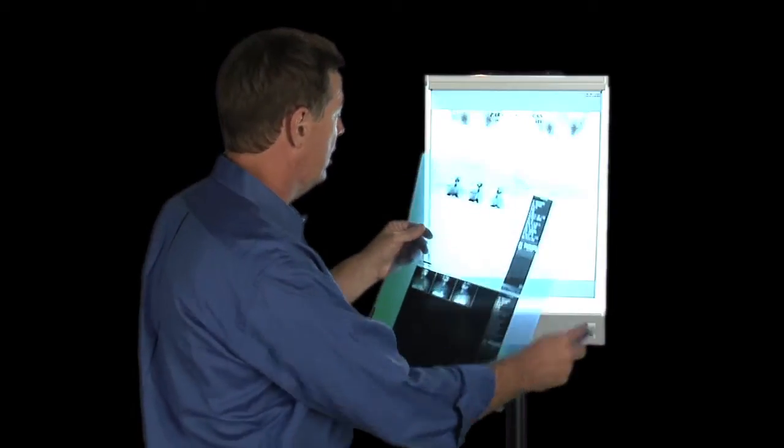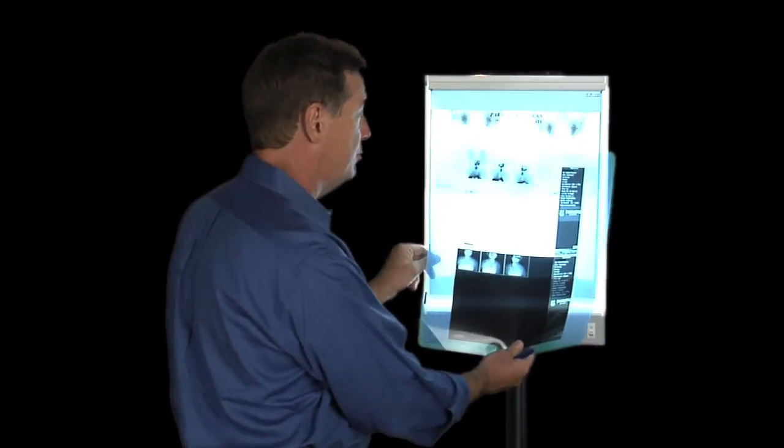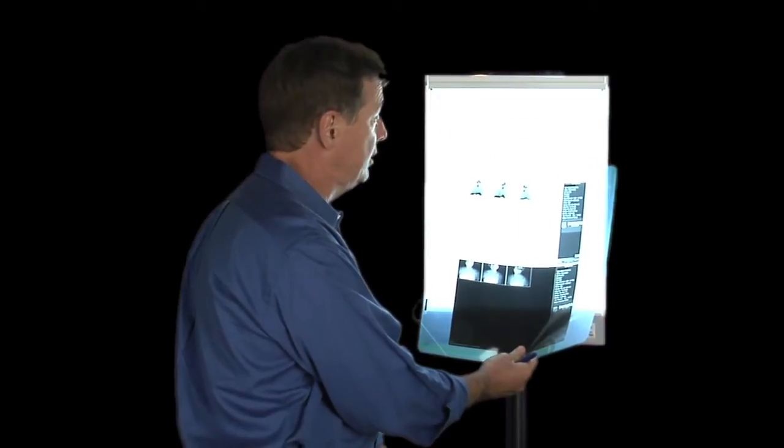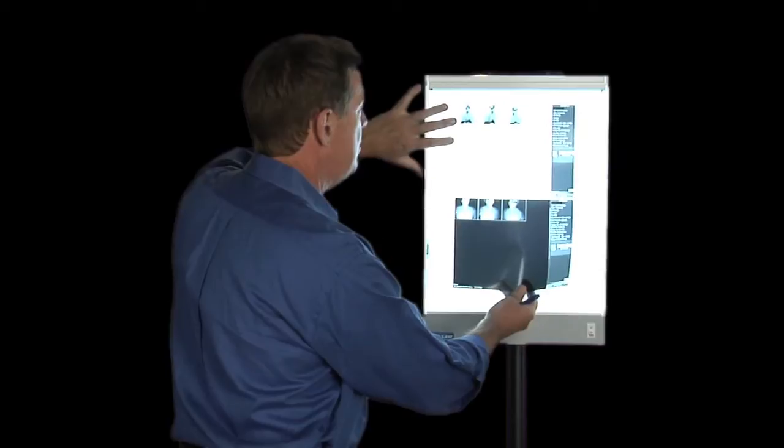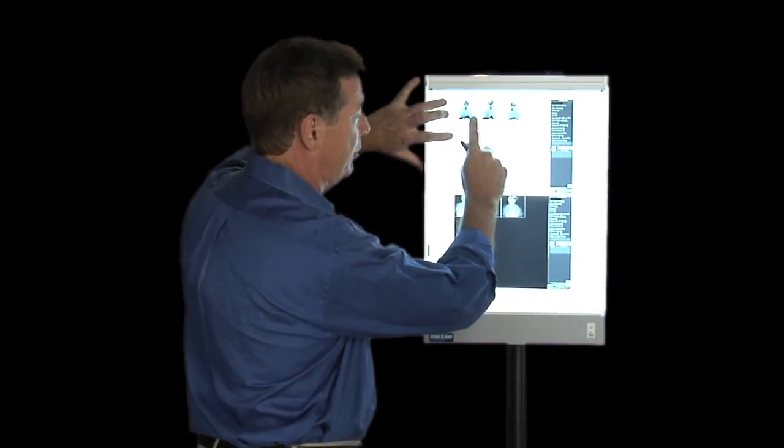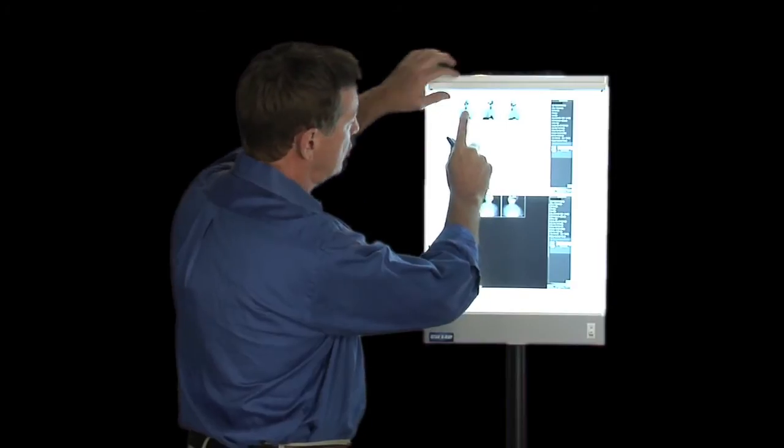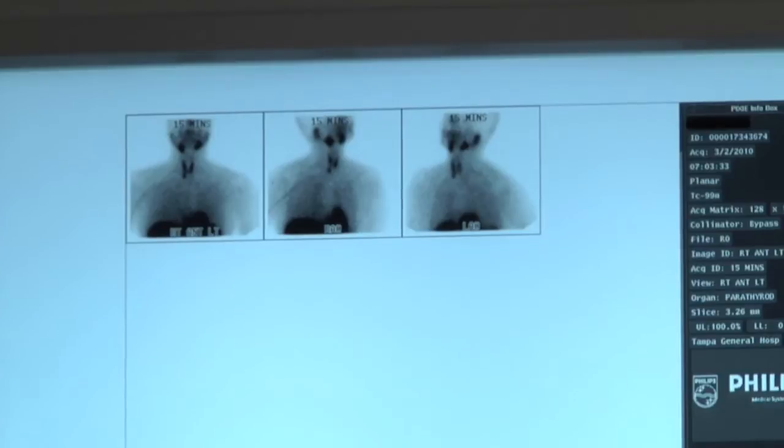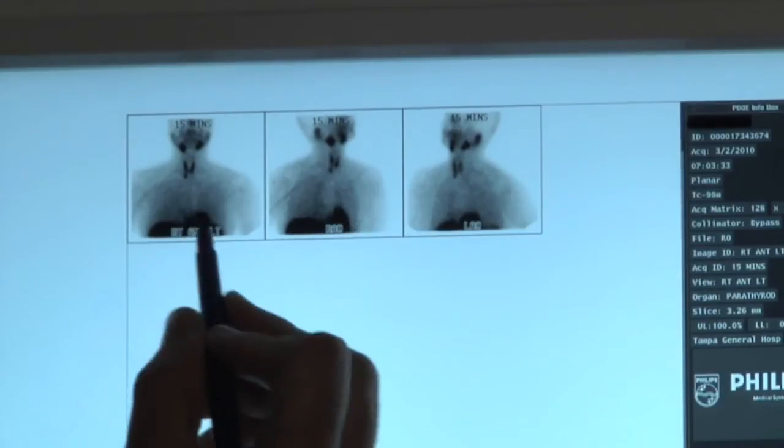That same patient has the Sestamibi scan done by us, by our team. Of course, we do several thousand of these a year. That same scan, that same patient, look how clean and crisp it is. Look how in focus it is. You clearly see the salivary glands, the butterflies, the thyroid, and the parathyroid tumor.